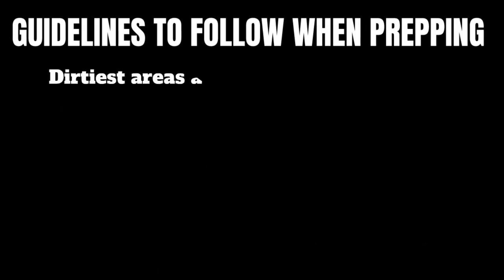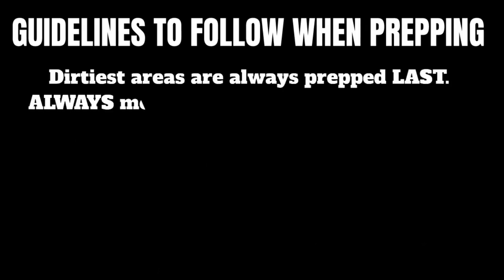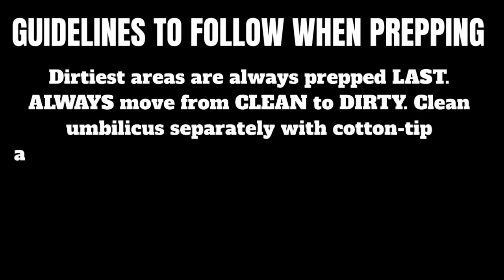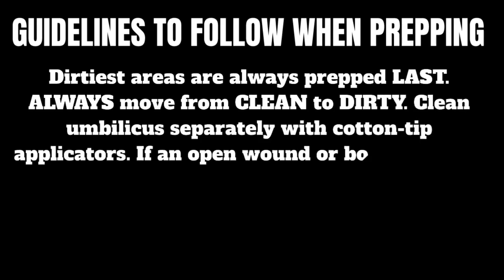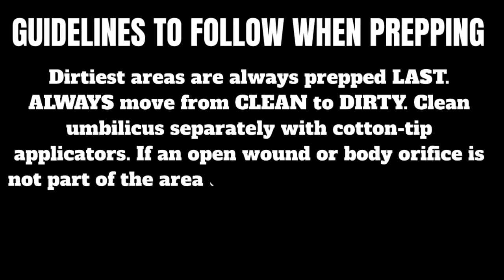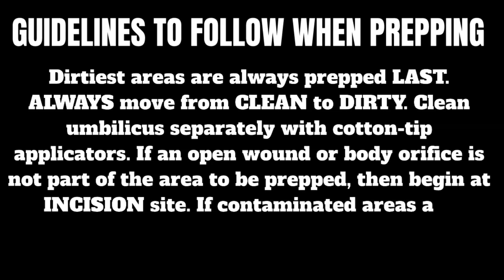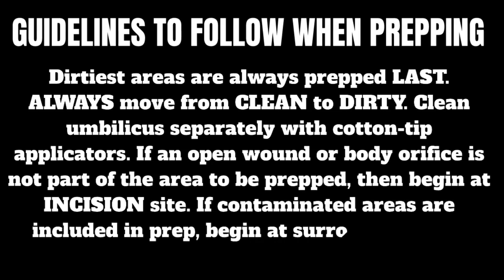Dirtiest areas are always prepped last. Always move from clean to dirty. Clean the umbilicus separately with cotton tip applicators. If an open wound or body orifice is not part of the area to be prepped, then begin at the incision site. If contaminated areas are included in the prep, begin at the surrounding skin area.